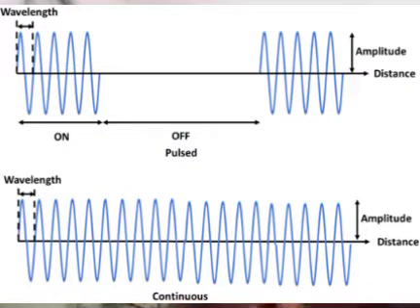So all diagnostic grayscale ultrasound imaging operates on pulse wave, as do color Doppler and pulse wave Doppler, except for continuous wave, which does not operate on pulse wave because it's continuous. So for real-time scanning and any other type of ultrasound image display, like A mode, B mode, M mode, the system must be operating in a pulse wave ultrasound mode in order to construct an image on the display.